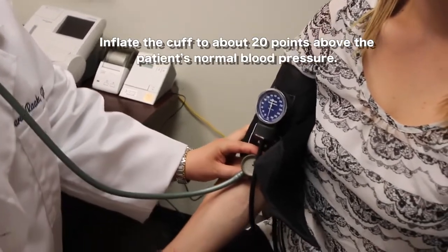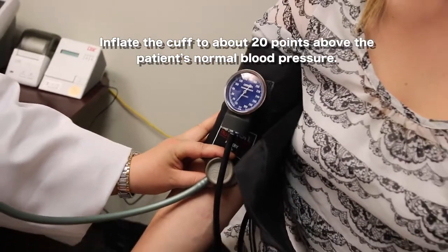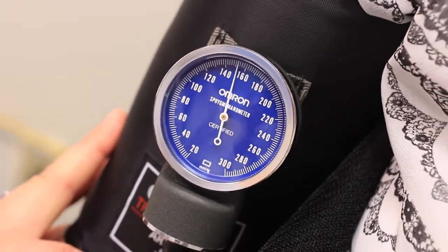The cuff needs to be generally inflated up above what the normal blood pressure reading would be. If we don't know what it is for a patient, we need to test it one time to see about what that cutoff line would be, and then we'll go up above it the next time to get a more accurate reading.